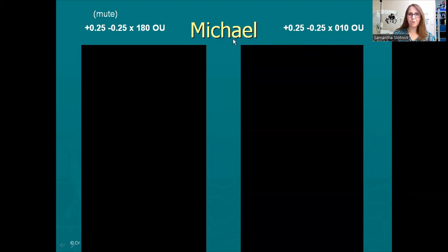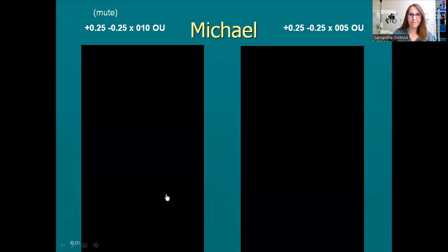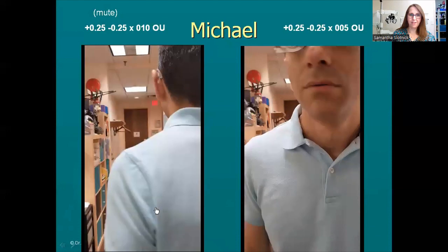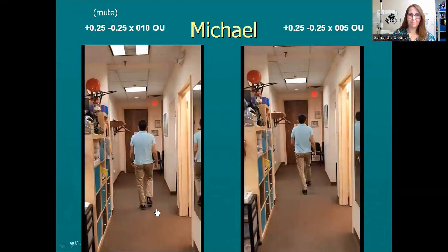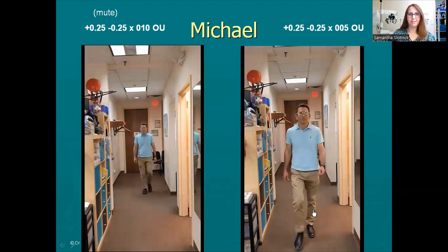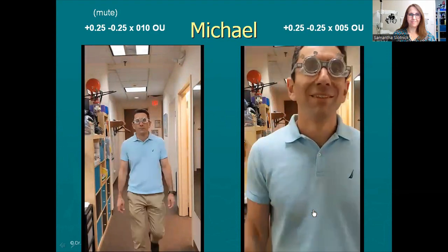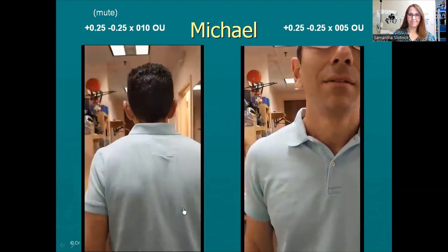So these were the two powers and orientations on either side of where we landed. And this is that same one that you just saw on the right. I've now brought it over to the left so you can compare it with our final. And the difference here, he's just got a little more ease. I like this. It's got the positives. You're moving a little faster, but with a little less power. It's like more grace. You feel like lighter on your feet.